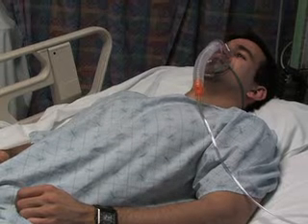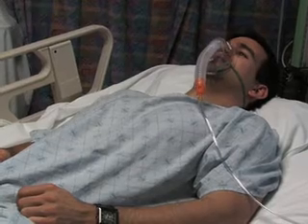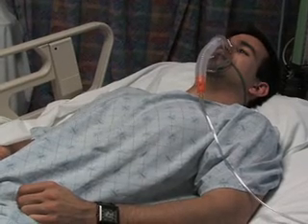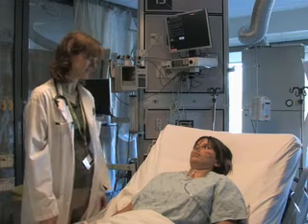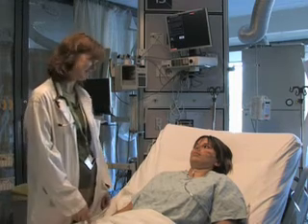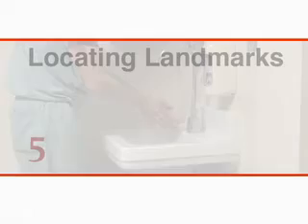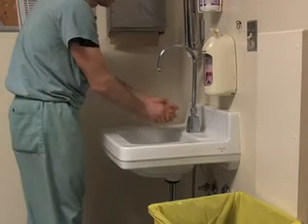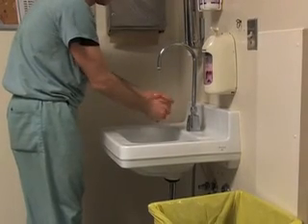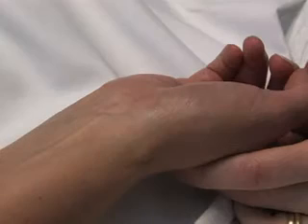Arterial blood gas sampling often takes place in an emergency setting and may not allow for obtaining consent from the patient or next of kin. When possible, the procedure should be explained to the patient and consent obtained. Wash your hands according to good standards prior to examining the patient.